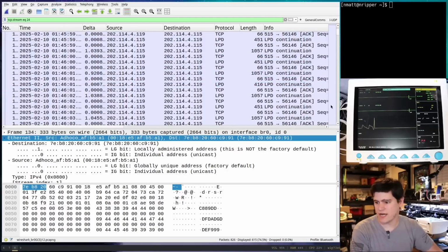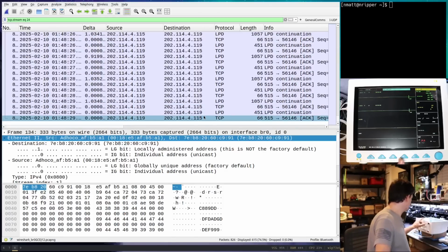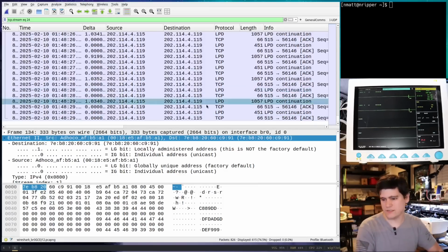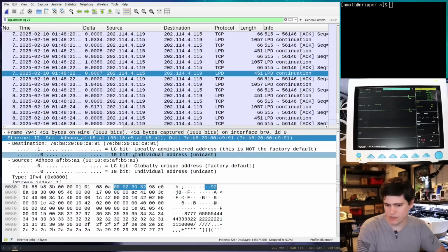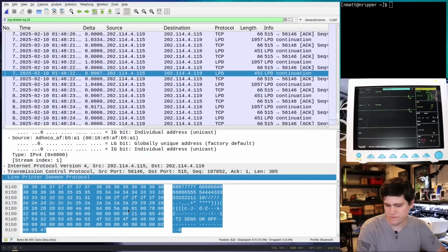So I'm going to hit stop on my packet capture. And I'm going to come down here, and then I have to tell this thing to silence because it detected that, oh no, the patient disconnected the device. All right. So here we go. Let's look at this packet. Let's see if I can find the right thing.